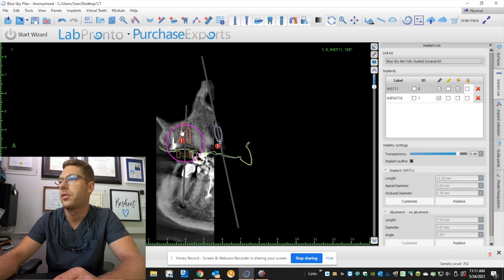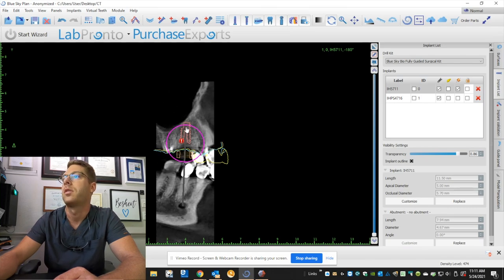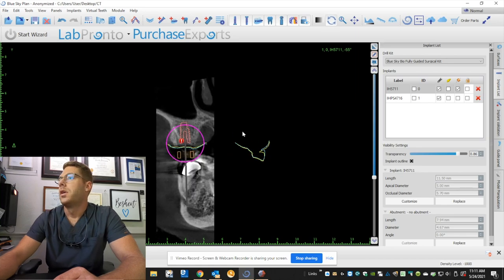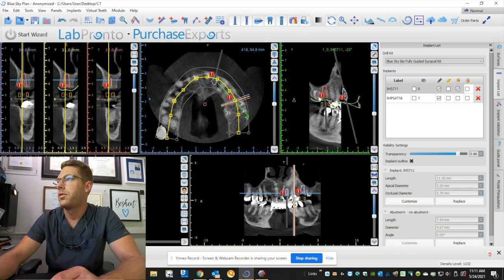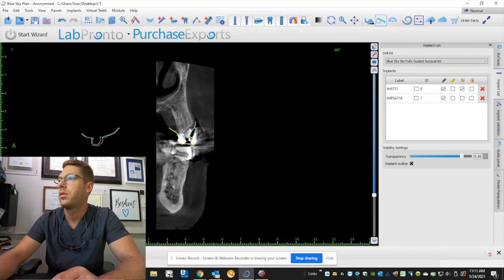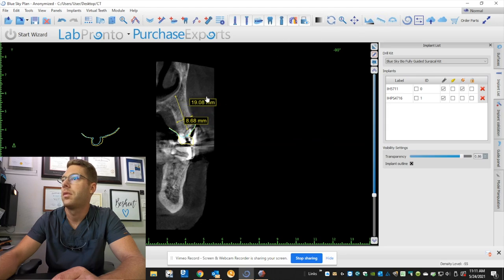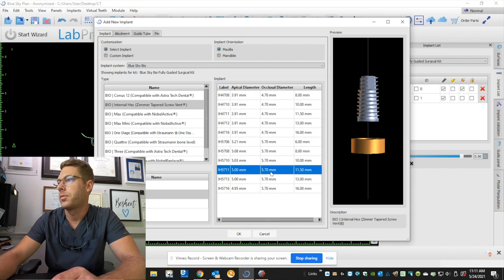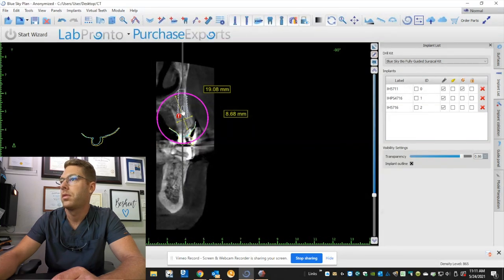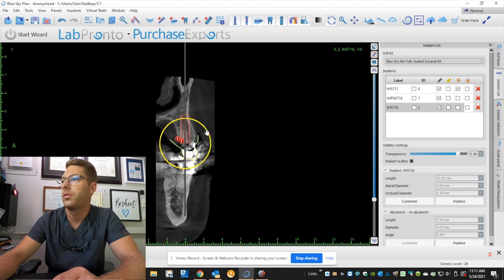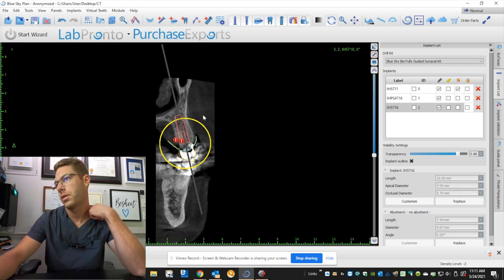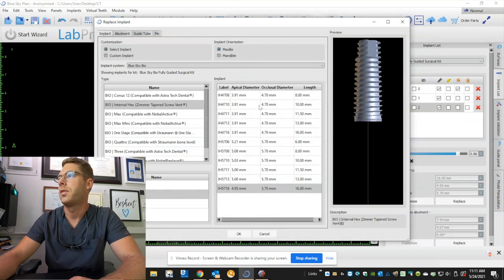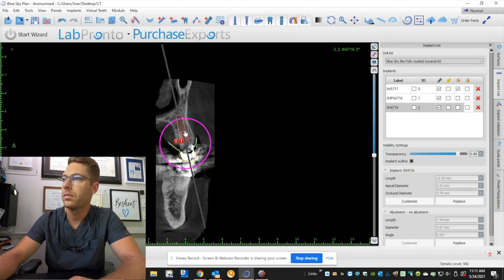And we're going to do one more implant immediate at 12 and 13. So let's measure how much bone we have here. We have plenty of width and plenty of depth. Okay, so let's place an implant. Let's do a six by 16. Okay, that's going to be too wide. I'm going to switch that to a 4.7. I like to have at least two millimeters between the bone here and the bone here. So let's go to a 4.7 by 16. There we go.